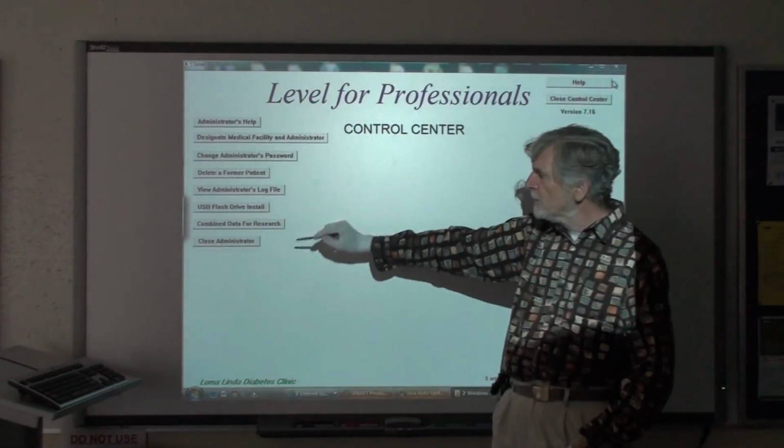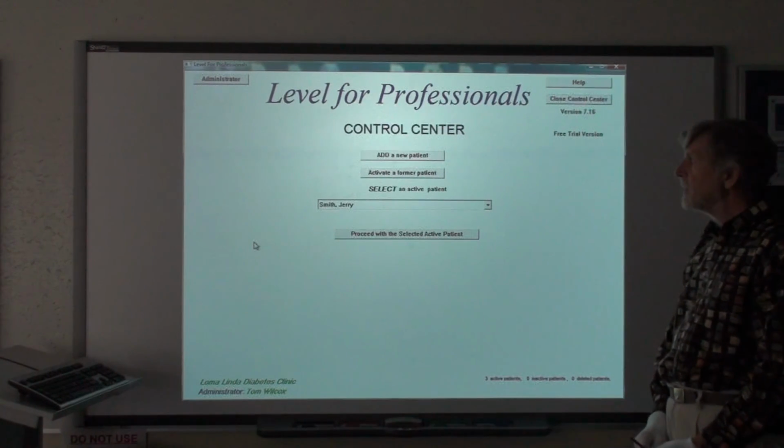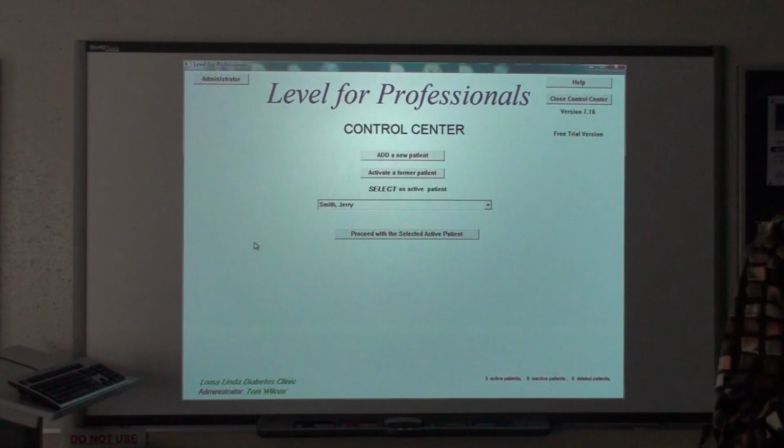These additional functionalities are available to those members of your staff that you designate as administrators.